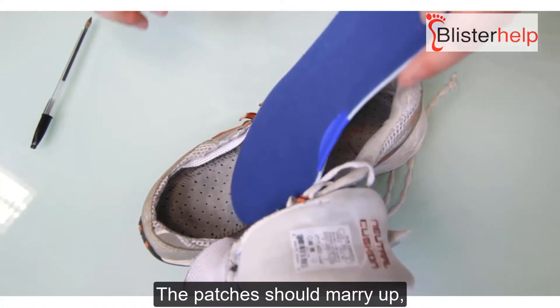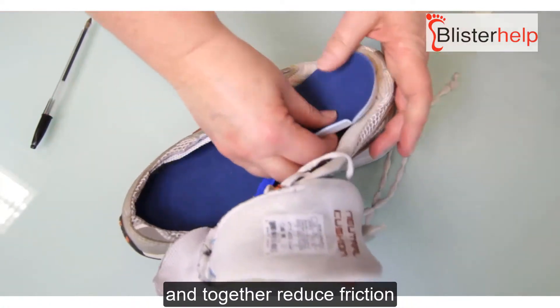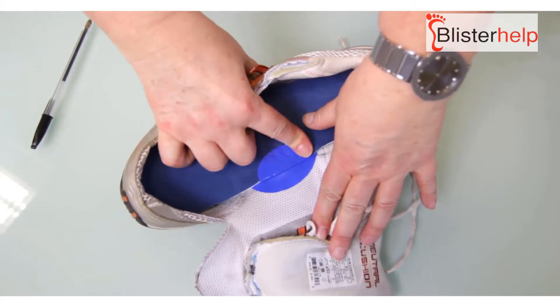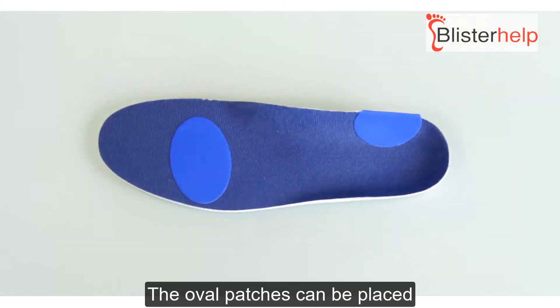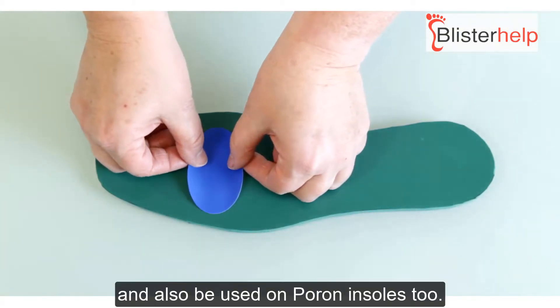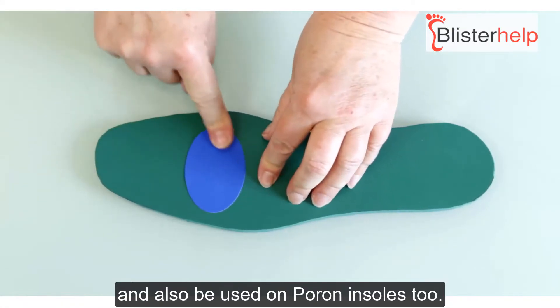The patches should marry up and together reduce the friction applied to the arch of the foot. Oval patches can also be placed where the balls of the feet are located on the insole, and can be used on raw insoles too.